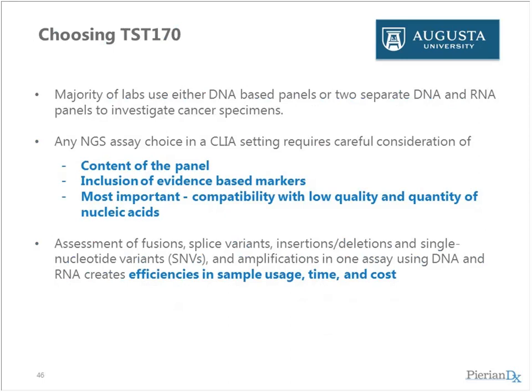But in a clinical setting, with any type of assay, irrespective of whether it's NGS or even a single-gene assay, a lot of careful consideration has to go into the content of the panel or the genes. Especially, you want to make sure that you have good evidence-based markers selected in the panel, so you're set for the next 3 to 5 years as a panel for clinical testing.